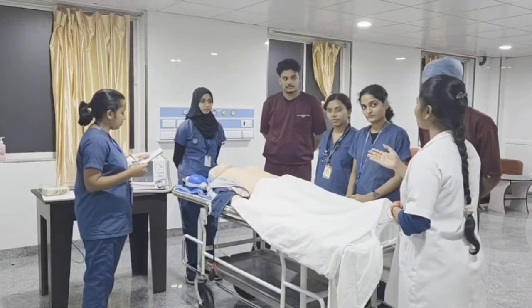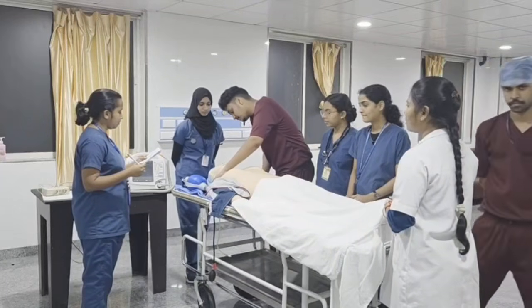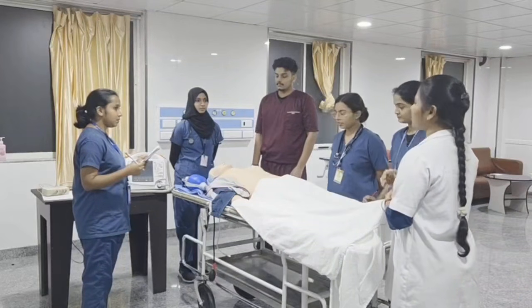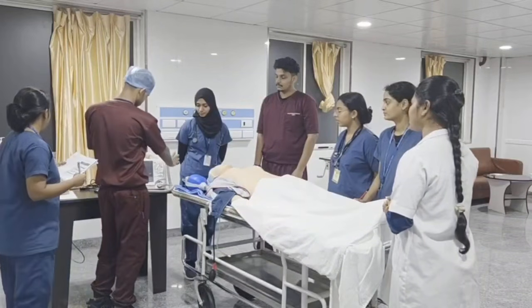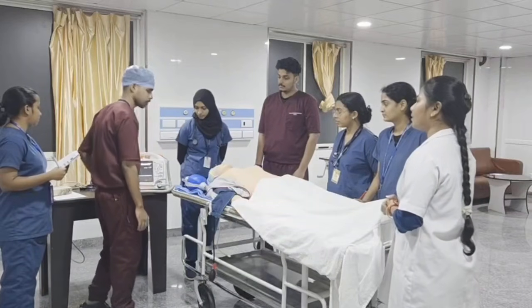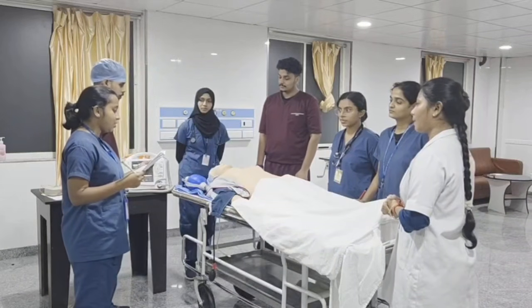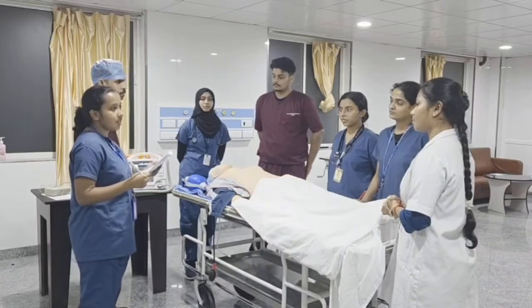Anand, could you assess the responsiveness of the patient? Ma'am, are you okay? Is the patient responding? The patient appears drowsy, pale and diaphoretic. Okay. Akash, could you connect the cardiac monitor to the patient? May I know the vitals of the patient, ma'am? Yes, heart rate is 130 per minute. BP is on the lower side, it's 72/40. Respiratory rate is 20 and temperature is 37 degrees Celsius.